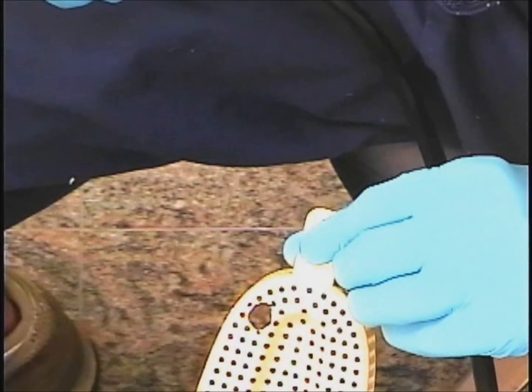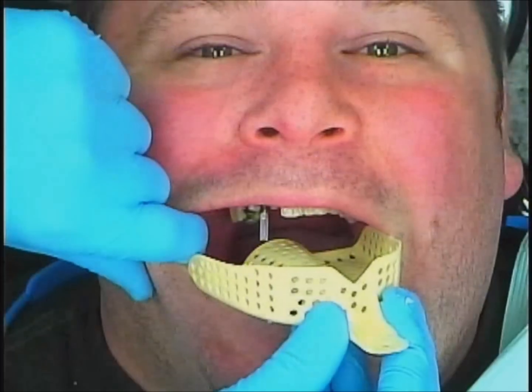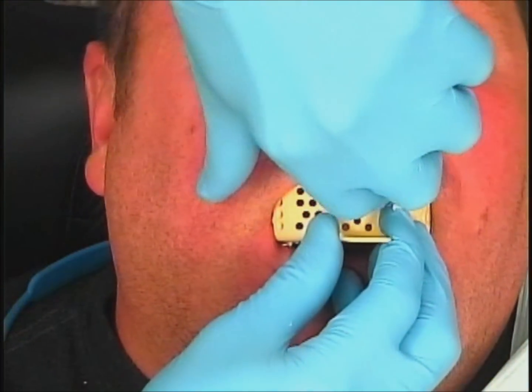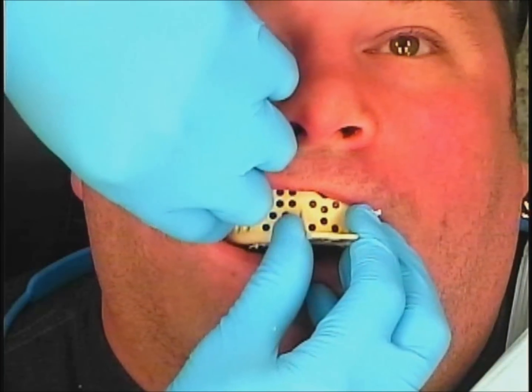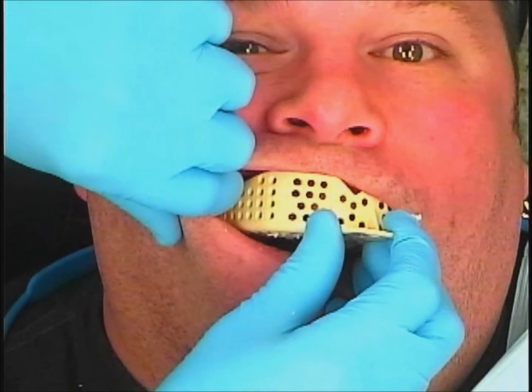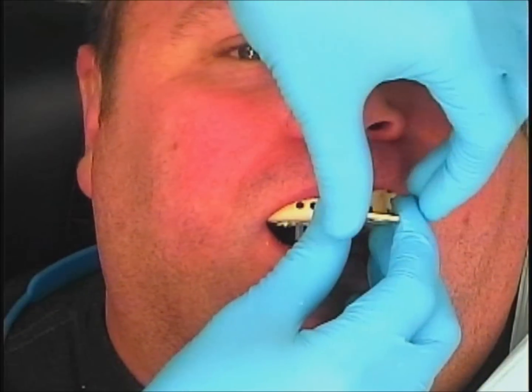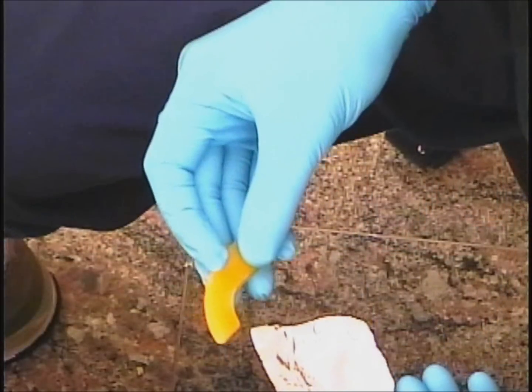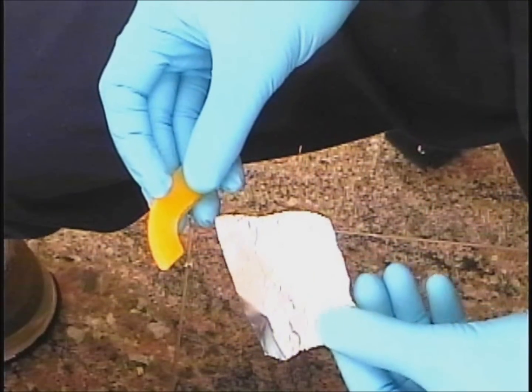You can see here I've now created a hole using an acrylic burr, and I'm going to then reinsert that tray into the mouth and make sure I put the hole in the right place. I also just practice a couple of times inserting this so that the impression coping sticks through, as you see it right there. And as you can see, that plastic tube really clears by a mile, which is great.